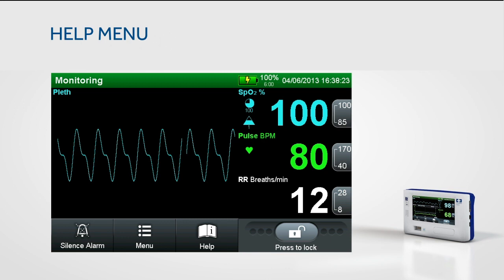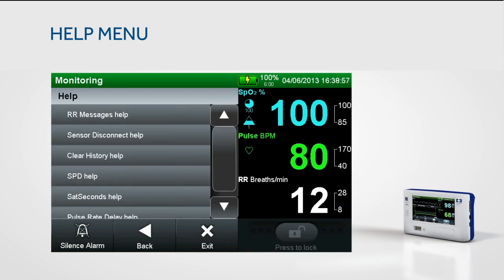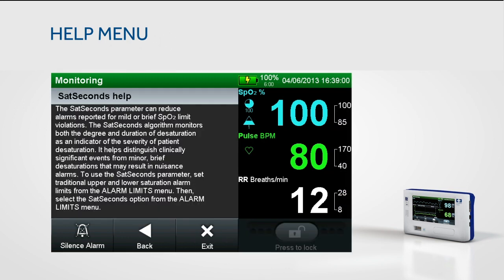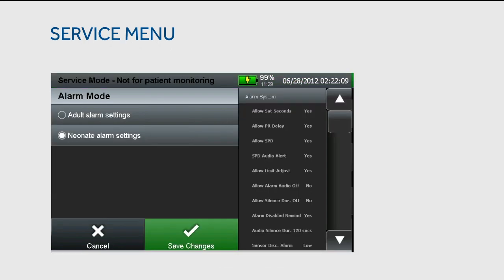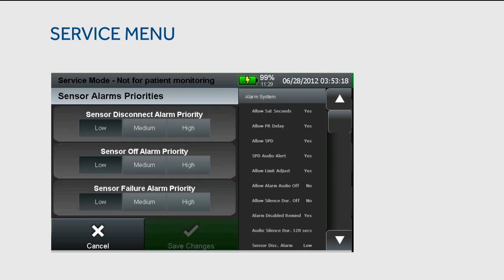The monitor offers a help menu, providing the user with greater detail without having to refer to an operator's or system manual. Beyond everyday use, users can modify settings and functionality within the service menu. The service menu is password protected and should only be accessed by approved personnel. This submenu provides additional settings that can be modified, including neonatal default and sensor priority settings.